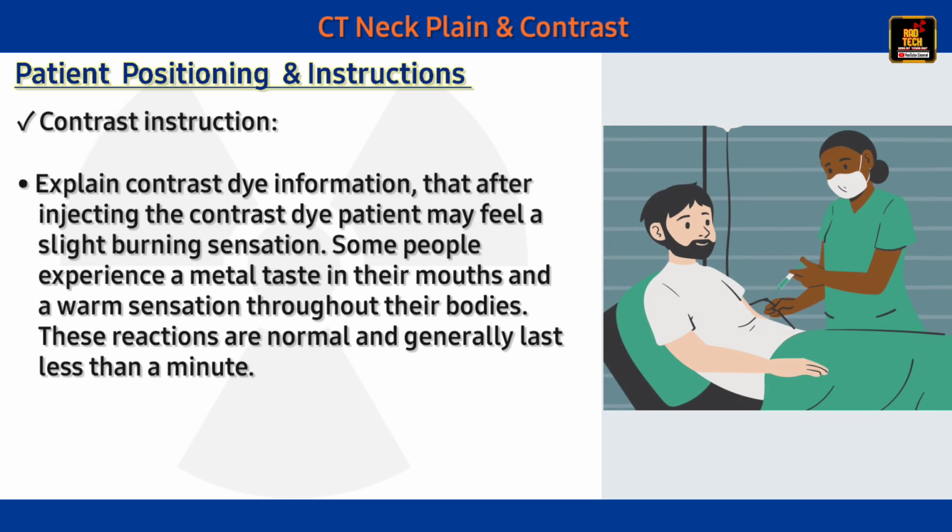Contrast instruction. Explain that after injecting the contrast dye the patient may feel a slight burning sensation. Some people experience a metal taste in their mouths and a warm sensation throughout their bodies. These reactions are normal and generally last less than a minute.